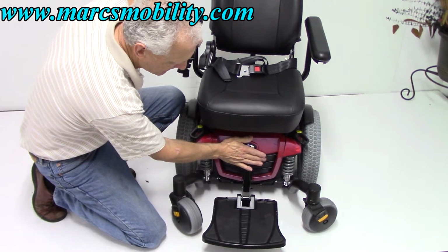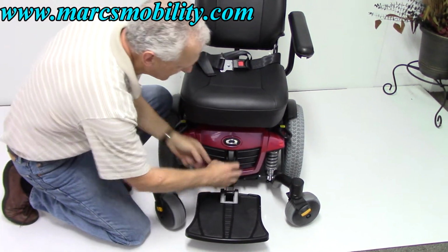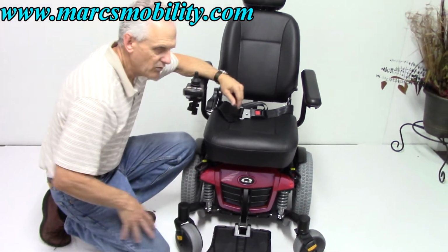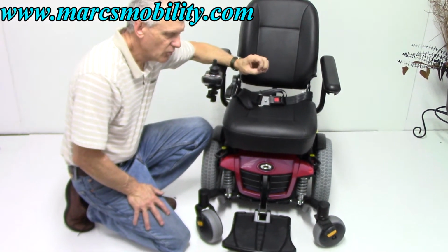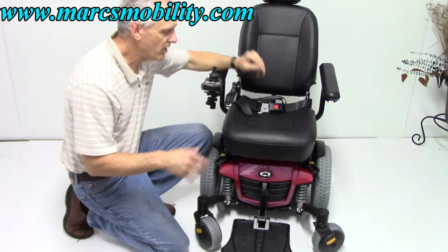If you need to change the batteries, the only thing you have to do is there's 2 levers here. Squeeze these levers in, and this front cover and the back and the foot plate will come out in one piece. And you have 2 batteries in there. They're 55 amp batteries, group 22, which will give you about 15 miles on the battery charge, depending where you're using it.